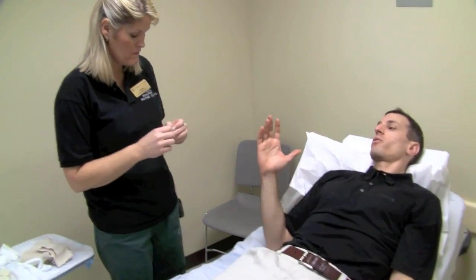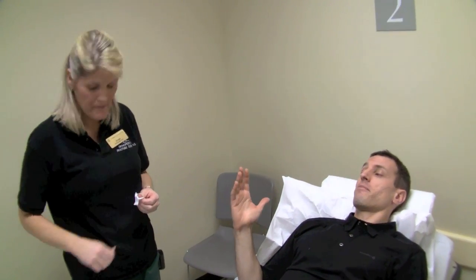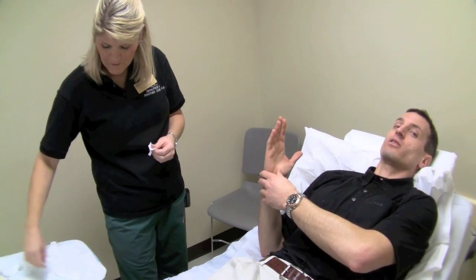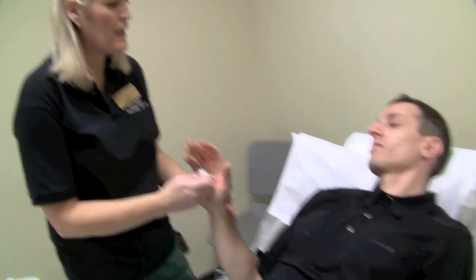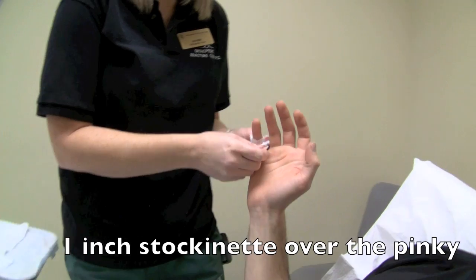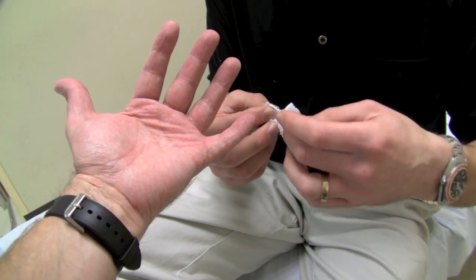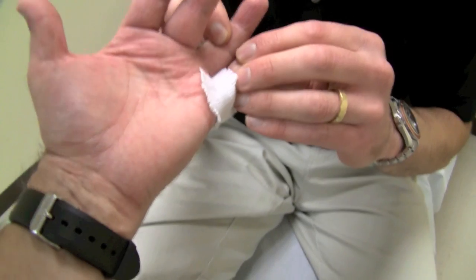Here comes the stockinette for our ulnar gutter splint, and this is a little bit more involved than the previous stockinette we've seen. The stockinette is applied to protect the skin from getting irritation from sweat and from the splint material. Step number one is our little finger sock — one over the pinky. This finger sock keeps the skin from rubbing.